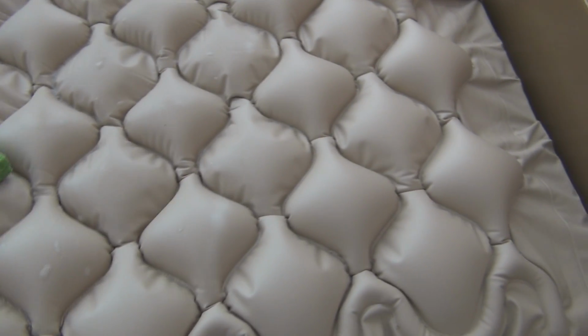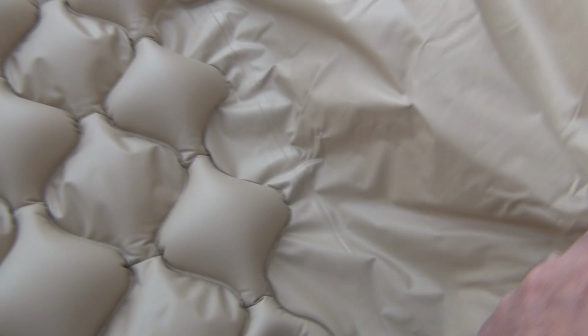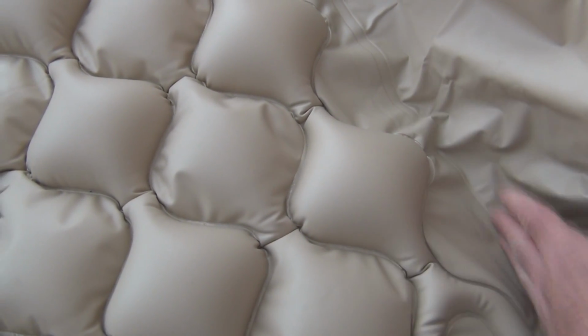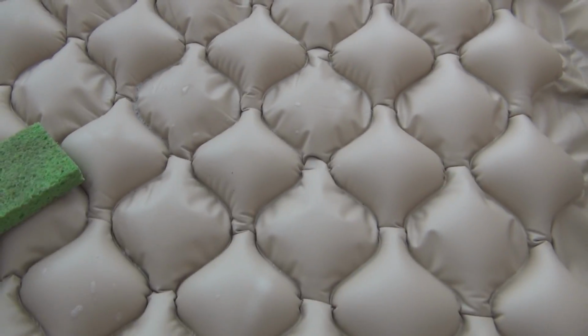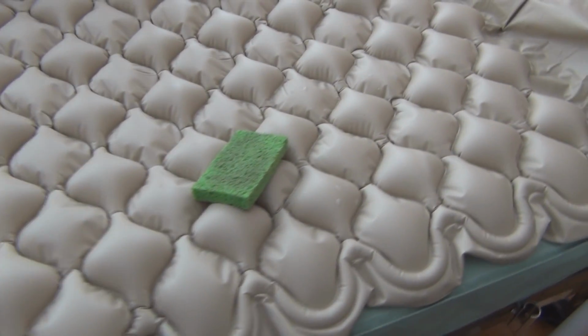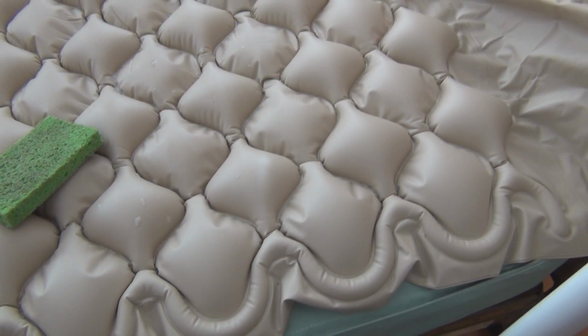One thing that you want to think about is there's two types here. There's one that's just this mattress cover, and then there's another version of it that has these extended flaps, just without the chambers in them, and those are good to have to tuck underneath the mattress, between the box spring and the mattress, because if it's just the other version, it's cut off right here, and it doesn't grab on anything. And this is vinyl, so it's kind of slick, and it'll slide around even if you have the mattress cover on top of this. So it's a good idea to get the one with these flaps on here. They have them on both sides, so you just sandwich that in between the spring and the mattress. And of course, on these medical beds, you don't have a box spring. It's just the washable mattress on top of the frame itself.